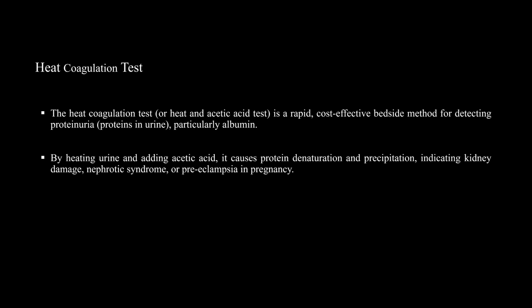Heat coagulation test. Heat coagulation test with heat and acetic acid. It is an effective, cost-effective diagnostic tool. Purpose: the test detects proteinuria, specifically identifying the presence of albumin in urine.